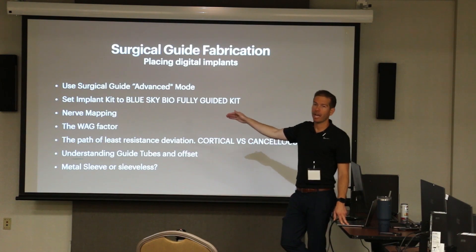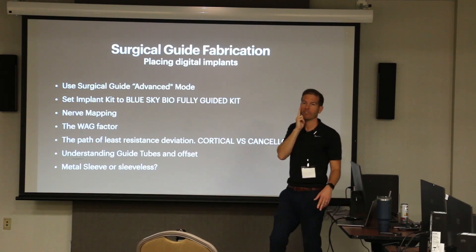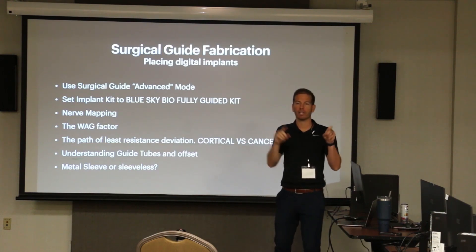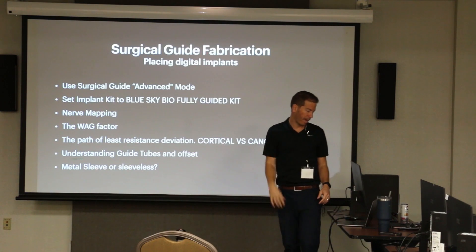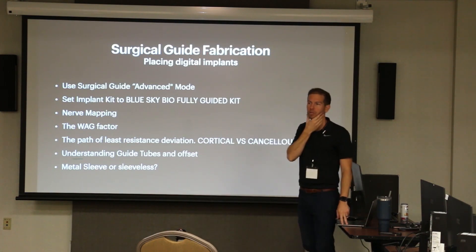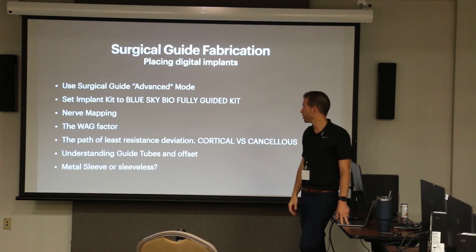Nerve mapping has become automatic now in Blue Sky Plans, which is kind of cool. Before, you'd have to go click the mental foramen, and then it would map automatically. Now it's just a one-click automatic nerve mapping. So when you're doing your lower posterior implants or your fully guided cases, make sure to map your nerves.